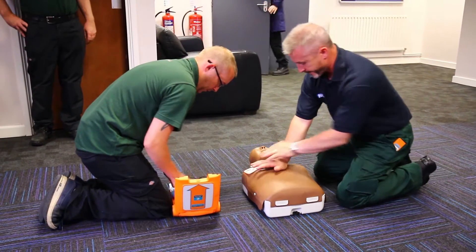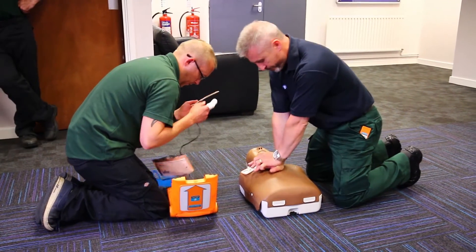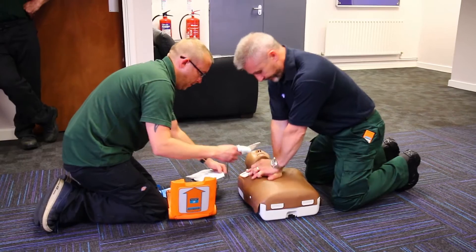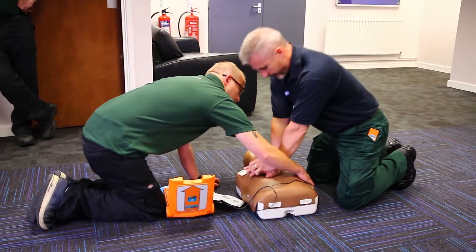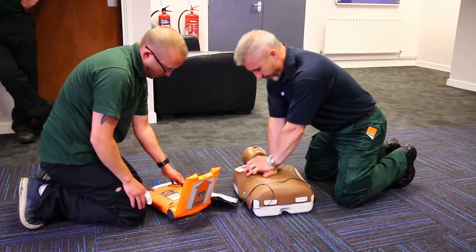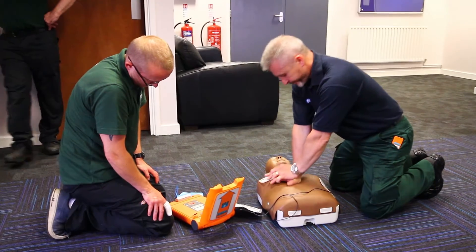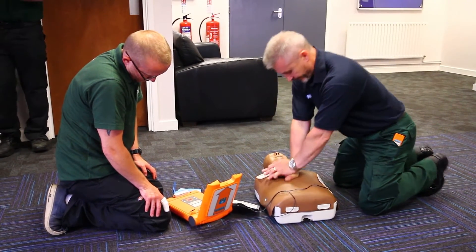Follow these instructions. Make sure emergency services are called now. Begin by exposing patient's bare chest. Remove or cut clothing if needed. When patient's chest is bare, remove the white square package from lid of AED.